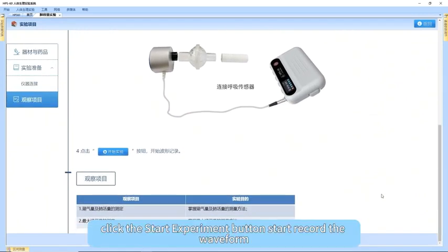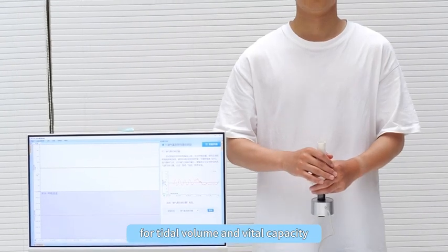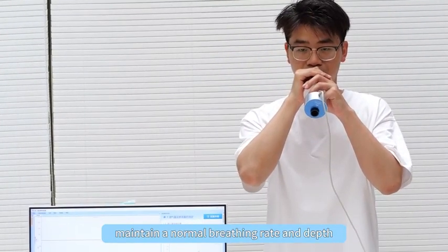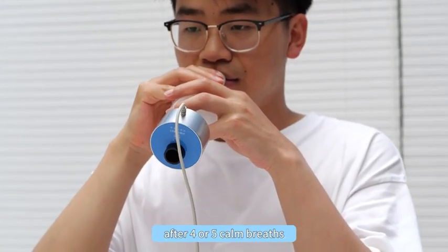Start. Record the waveform for tidal volume and vital capacity. The subject stands up and holds the breathing nozzle. Maintain a normal breathing rate and depth. Avoid consciously controlling breathing after 4 or 5 calm breaths.